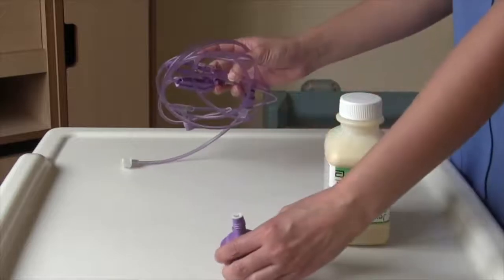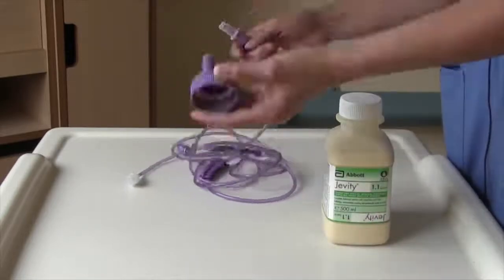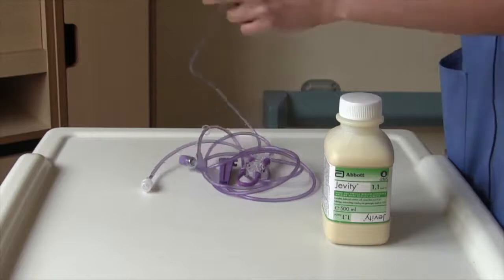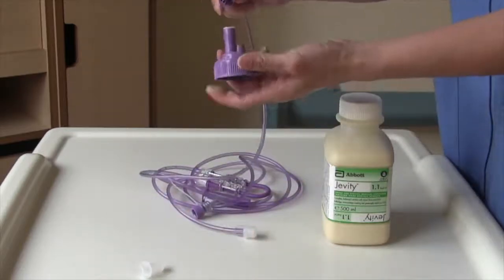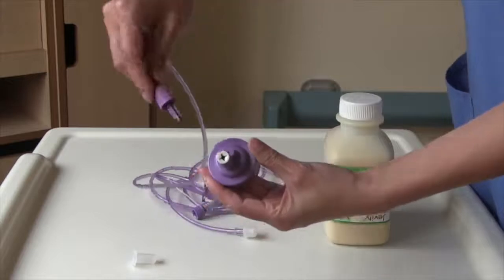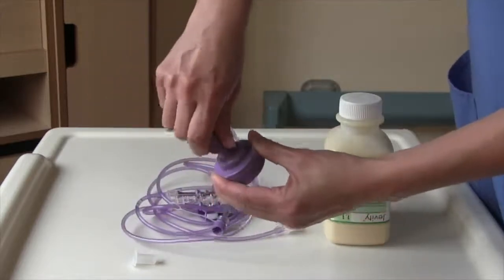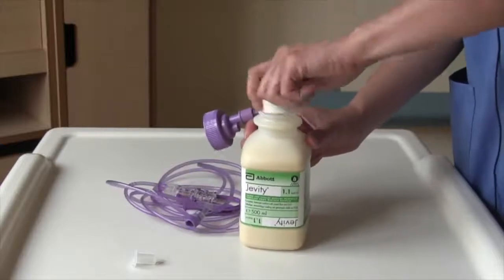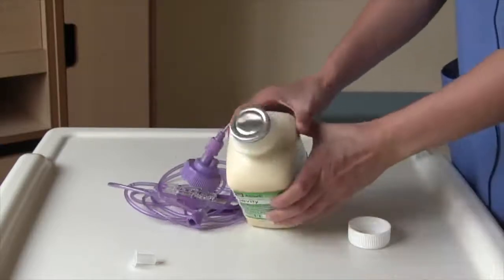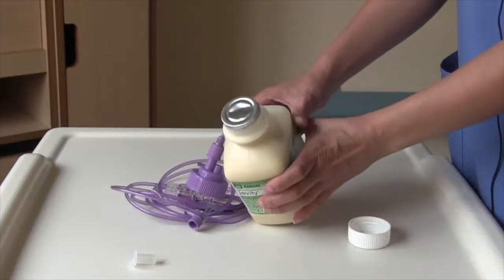Take the adapter and the giving set out of the packages. Connect your adapter to the giving set by finding the end of the giving set that has a long cap. Take the cap off and line the end of the tube with the insert of the adapter and turn to tighten. Take the protective cap off your bottle of feed. You do not need to break the seal with any objects. When you screw the adapter onto the bottle, it will automatically break the seal.